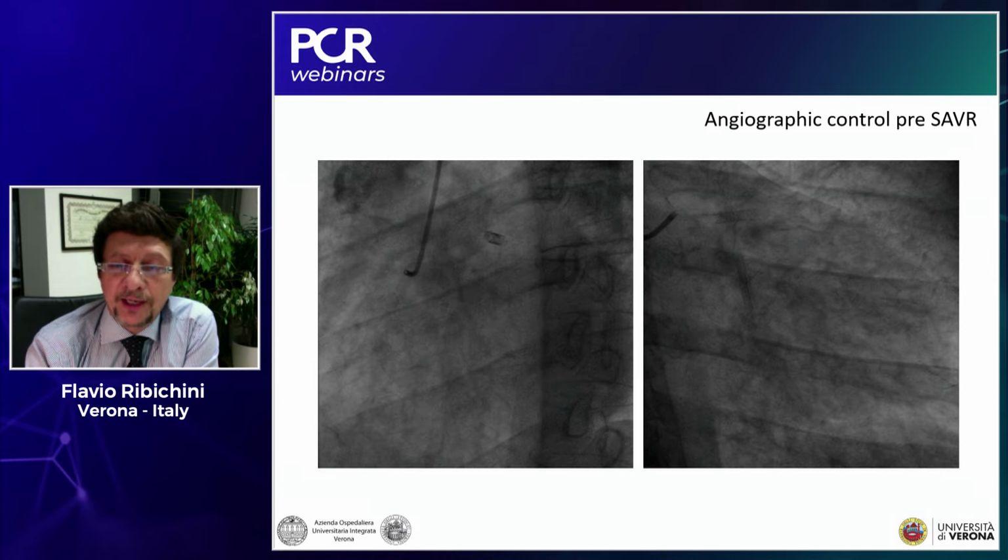You know, when we are talking about in-stent restenosis, we are talking about different clinical presentations and different angiographic presentations. And therefore, one of the first classifications looked at the patterns of in-stent restenosis angiographically. The decision was, do we see a focal or a diffuse or proliferative in-stent restenosis? Meanwhile, we learned that not every in-stent restenosis has the same underlying mechanism, and therefore newer classifications are dealing with the reasons why we have a restenotic stent: mechanical reasons, biological reasons, or mixed reasons for these findings.